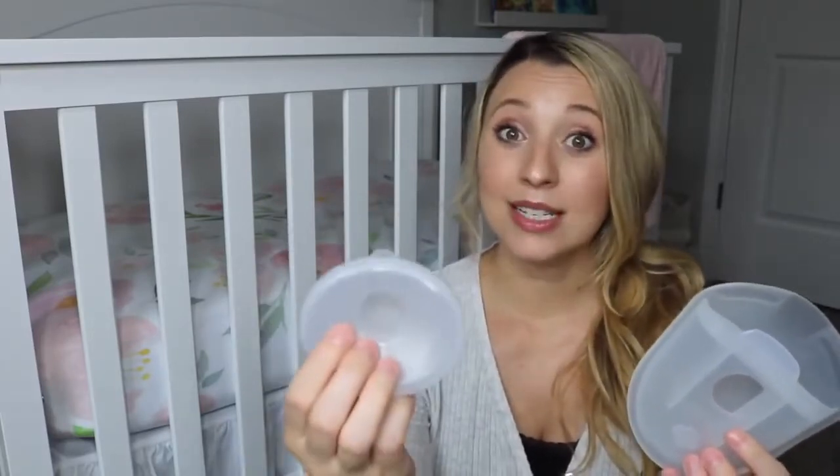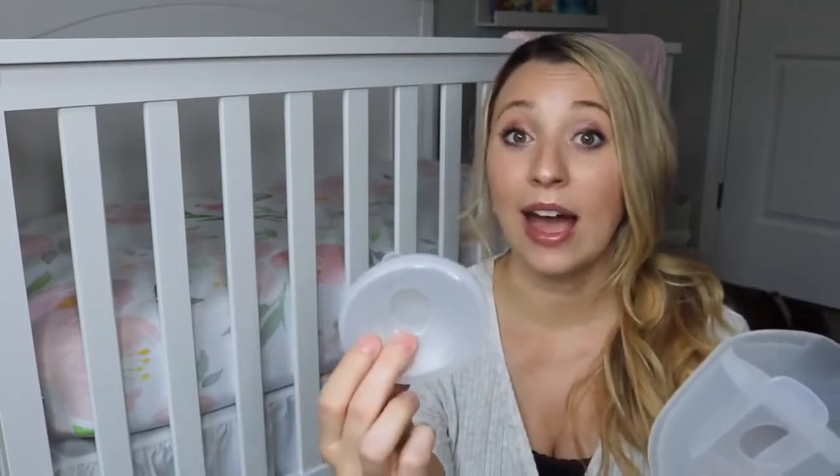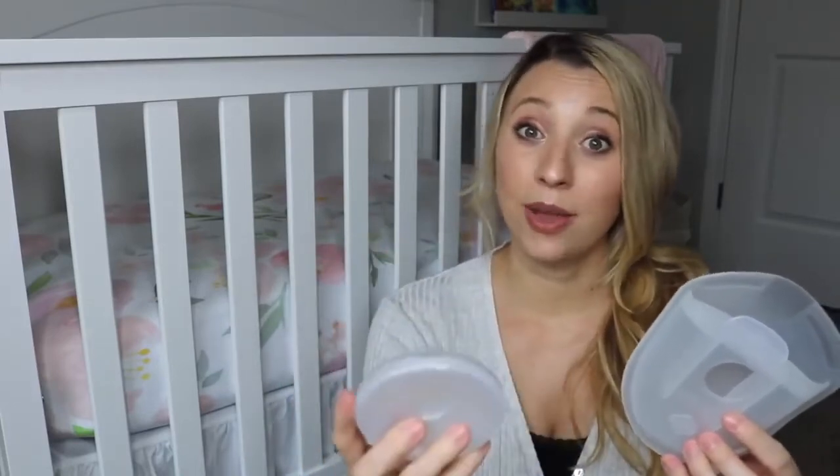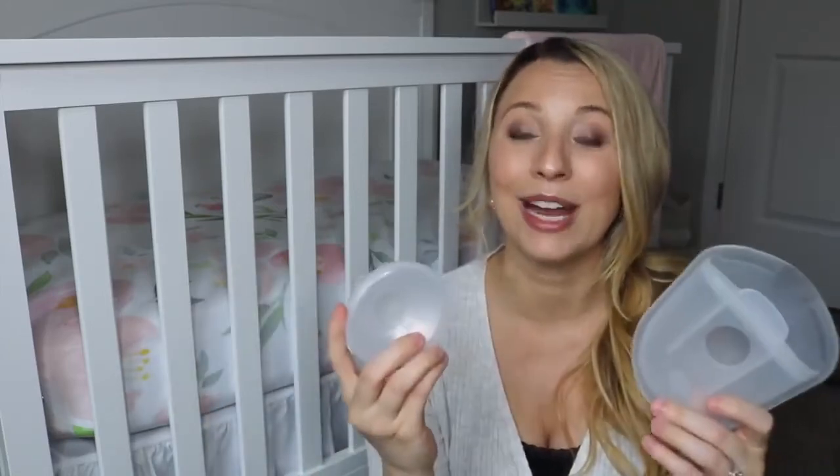I don't wear them out necessarily, but I do wear these around the house just in my nursing bra, and then periodically I'll just pour them into a milk bag to freeze. That's just a way I've been building up my milk supply in the freezer because I don't really have to do anything — I don't have to pump that much because I have these, and these come in super handy.